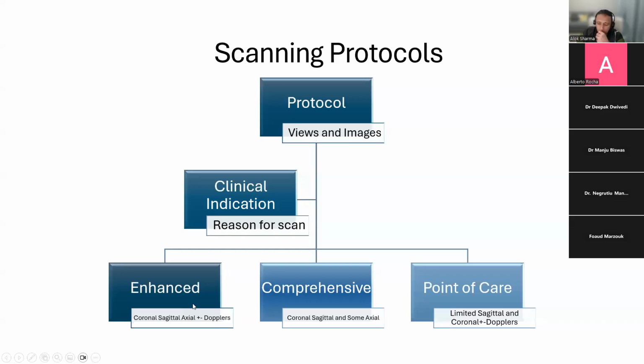In total, that'll come out to approximately 23 images. Now, that's a lot of handling for an extremely preterm 23-weeker where you're doing a golden hour scan, which is not necessarily the best thing.